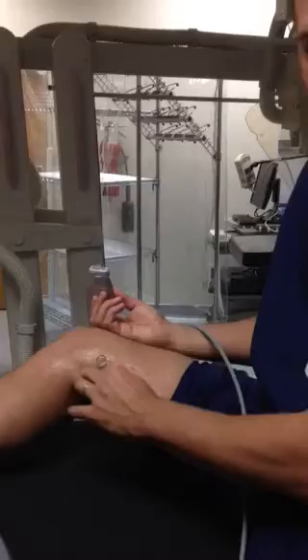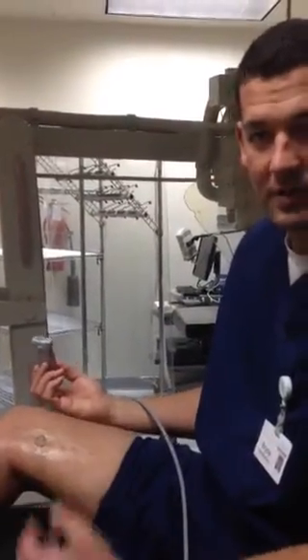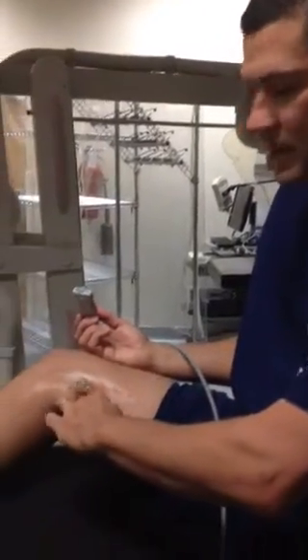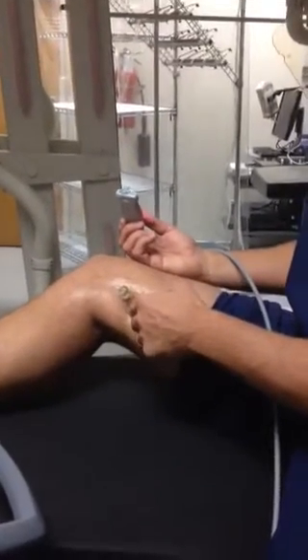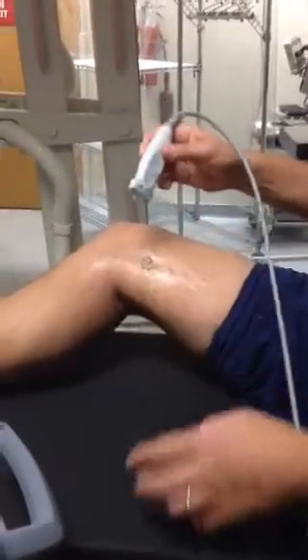You're going to place the leg in a frog leg position, while prepping the patient in the same position that the harvester is going to be harvesting from. Your landmark is going to be right in the groove between the muscle and the tendon. The vein is always lower on the leg than you think — you could spend a lot of time looking above, but you definitely want to start in the lower half.